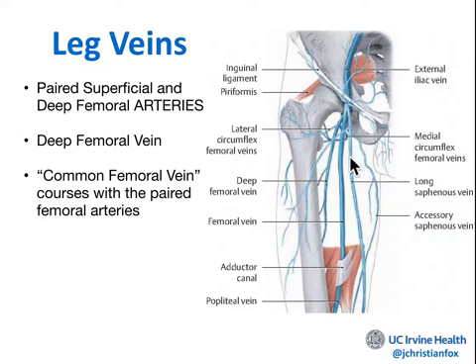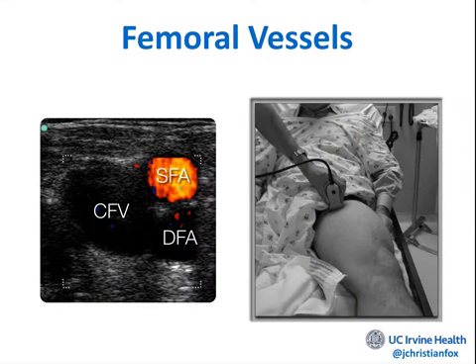The saphenous vein is very superficial, and sometimes you'll see a superficial clot up here in the saphenous vein. But where that saphenous joins the femoral vein, that's where I start. Then I start making my compressions, and I go distally, in 1 centimeter increments going down the leg. And eventually you'll see this.